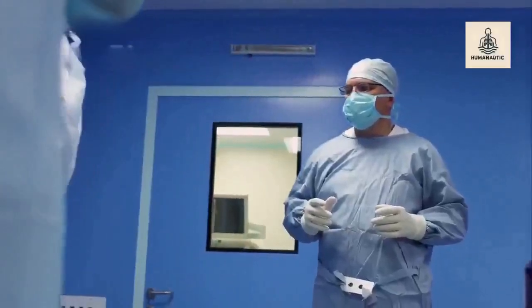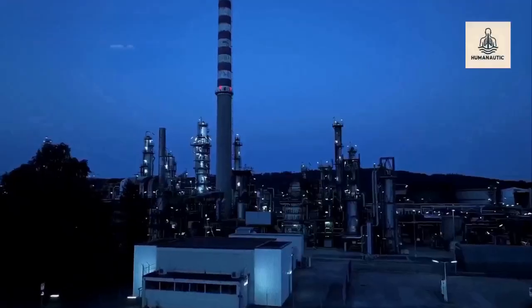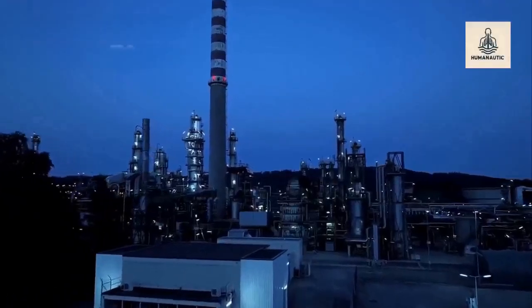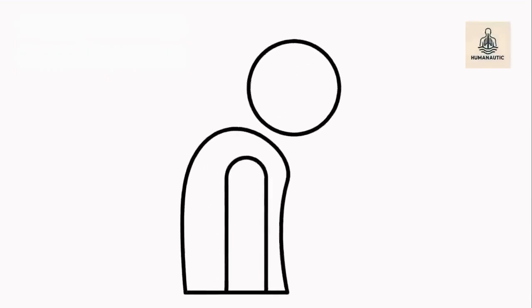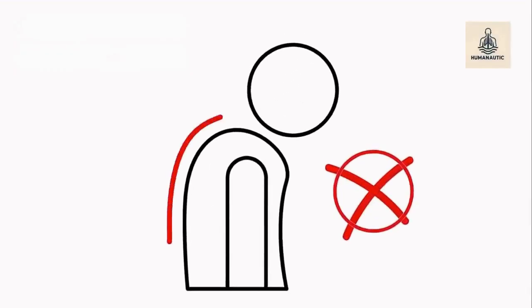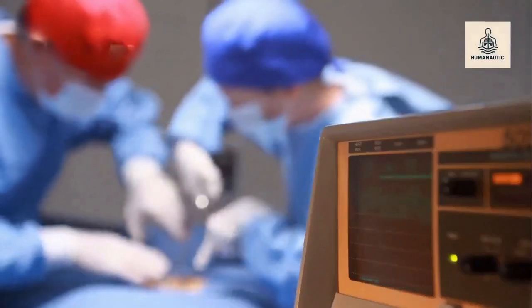Safety, physiology, and ergonomics. Laparoscopic surgery introduces unique safety considerations. Students should understand how carbon dioxide absorption affects ventilation, cardiovascular effects of increased intra-abdominal pressure, the importance of surgeon ergonomics, monitor height, hand position, and posture, the role of coordinated communication within the surgical team.